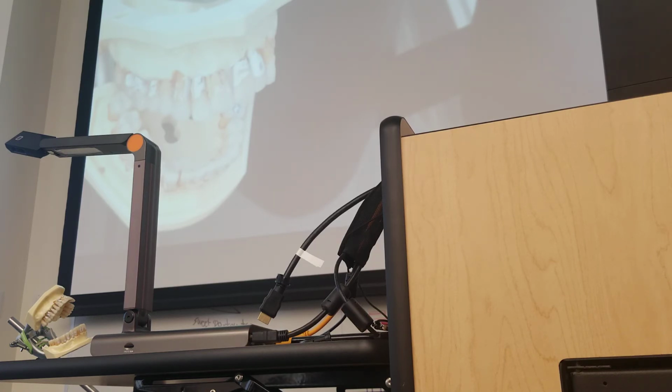Okay, what about down here? It's different for mesial and for distal. It depends on whether you're doing maxillary. Here, this is the outer edge, so you're going to put that here. When you go to distal, it's different. So for distal surfaces, it's going to be like this, and then you're going to flip it to go to the mesial. Okay, I just want to make sure, because that's the outer edge. Yeah.